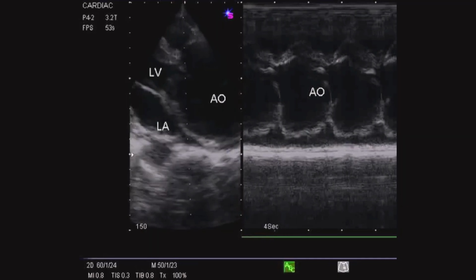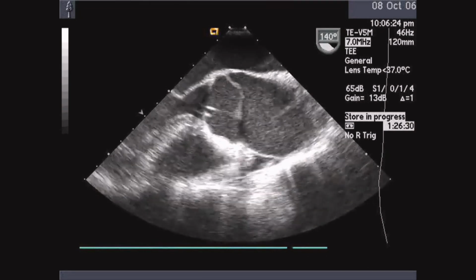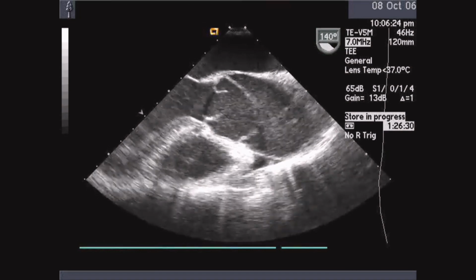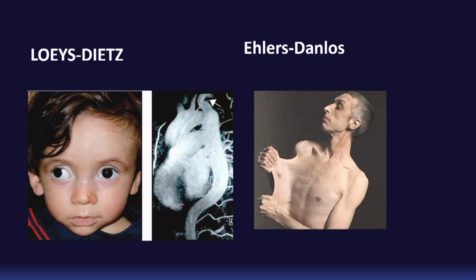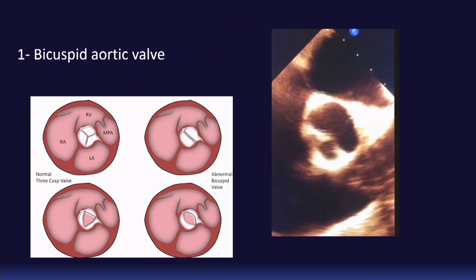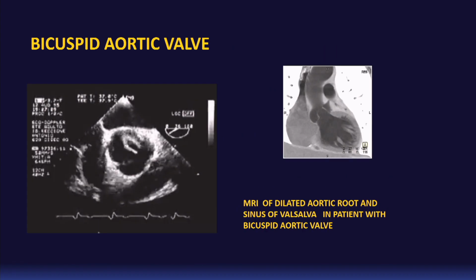in the proximal ascending aorta. Whenever you see a patient with aortic dissection, you catch from the ascending aorta, please move your probe to another site. So you can pick up the arch of the aorta from the suprasternal, and even you can go to the abdomen. Sometimes the dissection could be extensive, and you can catch the intimal flap by putting the probe over the abdomen and looking for aortic extension of the dissection into the abdominal aorta.